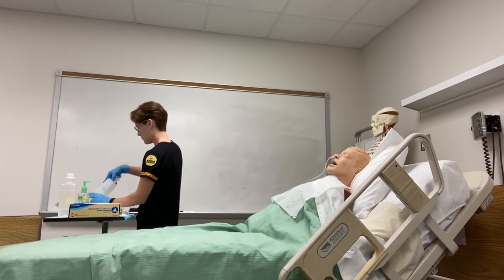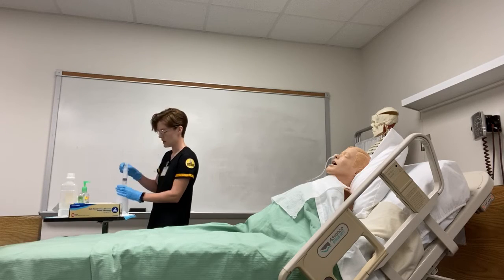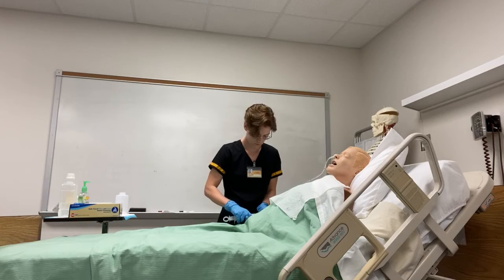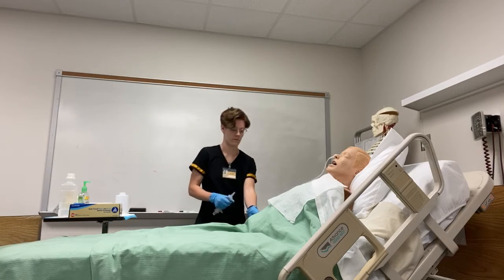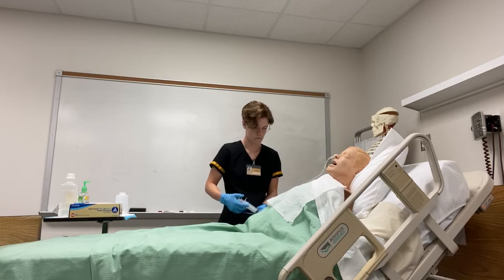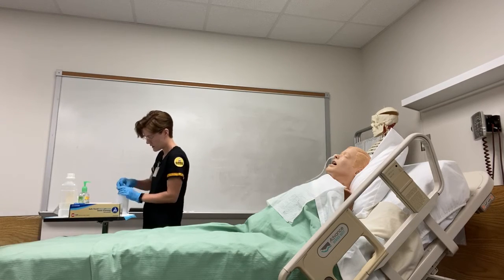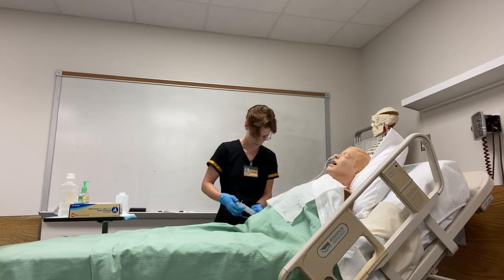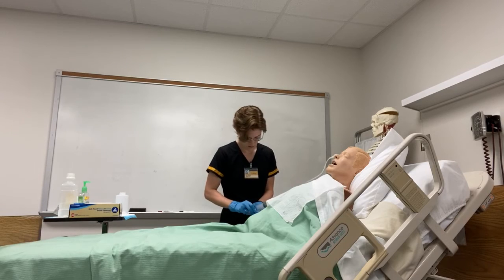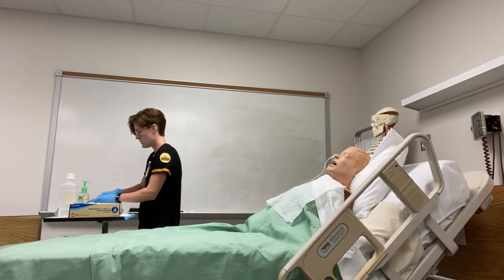So I'm just going to get my syringe out with my saline solution. So I'm going to draw up some normal saline. I'm going to come and I'm going to flush the tube. Now that the tube is flushed, I can drop my medication. I'm going to come back and get some more saline and flush the tube again. All right, now that the medication is administered, I would clean up and I would leave the room, but I have an order that says that the NG tube has been discontinued.